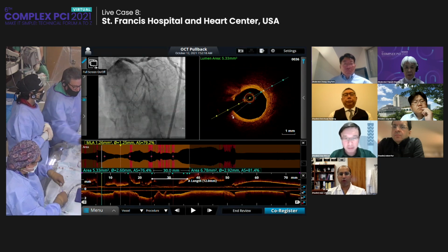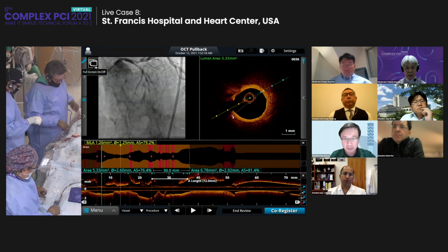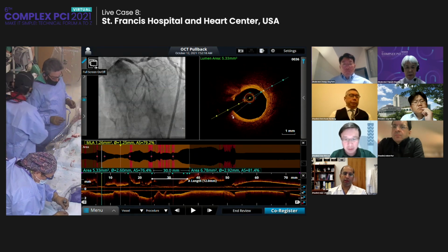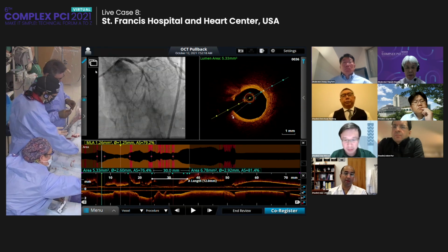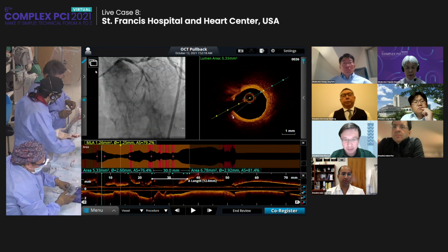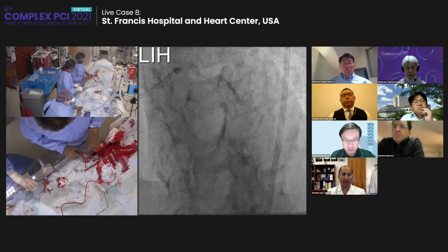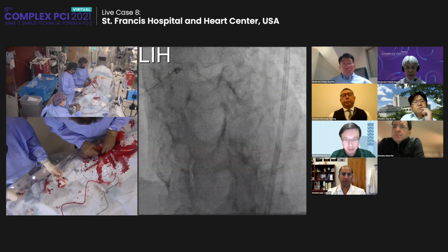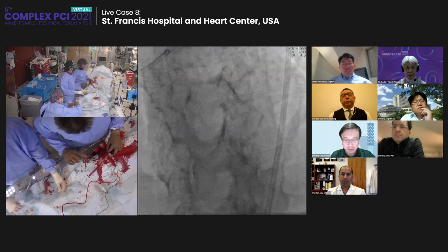Z, I'm going to ask you a theoretical question. Because of that nodular thing that's there, do you worry that you don't get as good apposition with the Shockwave to transmit the energy, and maybe in those circumstances you deflate, reinflate, or go up a little bit higher than 4 atmospheres, or is that more just theoretical? No, I don't really tend to do that.